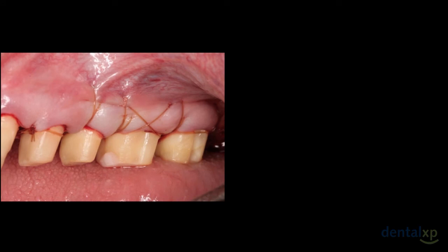Here you clearly see the flap sutured. You'll notice about 6 millimeters from the gingival collar is where the sutures enter into the flap, engaging the periosteum underneath and coming out. This again tacks the flap down to the periosteum and the flap cannot move. What's the beauty? You can place your tissue exactly where you want it and it will stay there through the entire length of healing. I want all flaps to be just coronal to the bone.